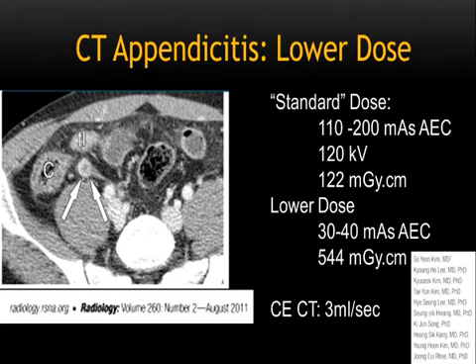When the patient comes with a suspected appendicitis, if it's a regular hour, we try to get a graded ultrasound. If that's not diagnostic, I'm talking about patients who are less than 18, we go for MR. When MR is non-diagnostic, we go for CT. It's never the other way around. Right? So we don't get them as often as we used to.